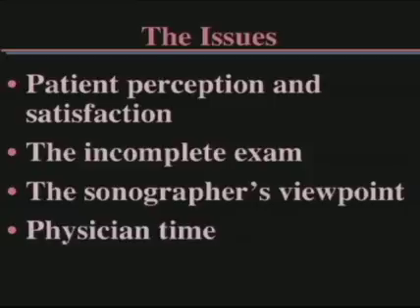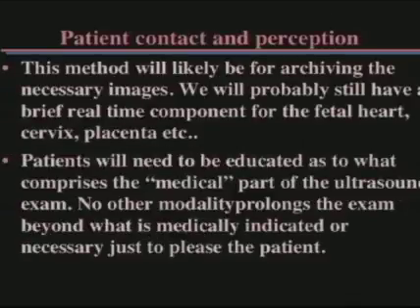Now, just to finish up with a few issues that may have come to mind as I went through this, how is the patient going to perceive this? Is the patient going to want more scanning time to view the baby? What happens when the scan is incomplete? How about the sonographer's point of view? Are they going to be able to keep their jobs? And have we increased the time that the physician must put in?